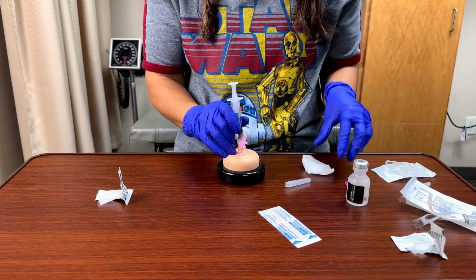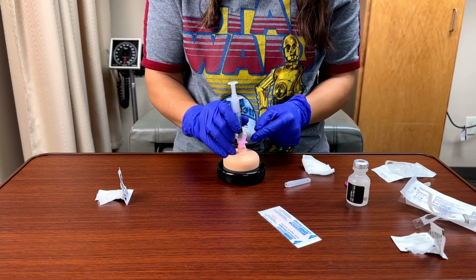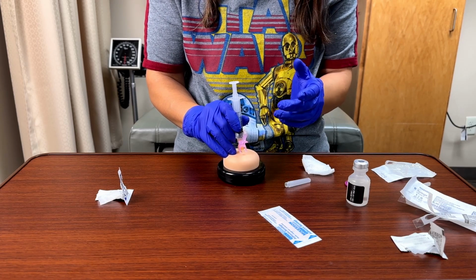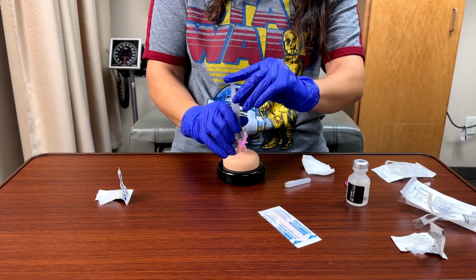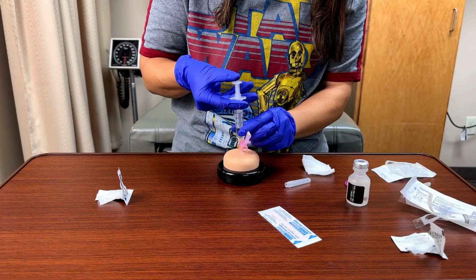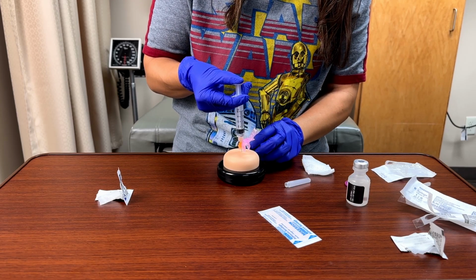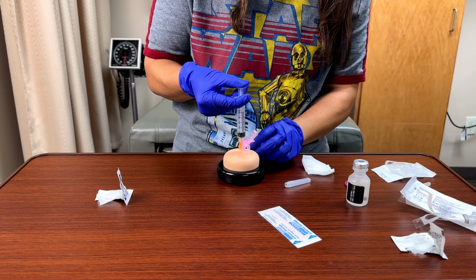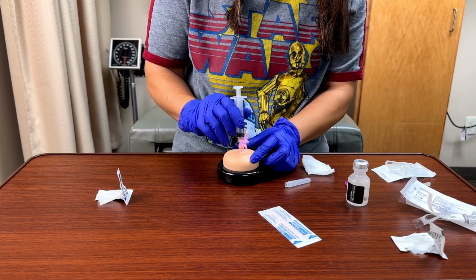Okay. Current literature says we don't have to withdraw to make sure that we're not in a vessel, but on our rubric it still has that instruction. So I'm going to withdraw slightly to make sure that I'm not in a vessel. Nothing should come up. Okay. Once I'm done with that, I can apply gentle pressure to push the medicine in, slowly and gently. Okay, once all the medication is in, I'm going to smoothly remove.